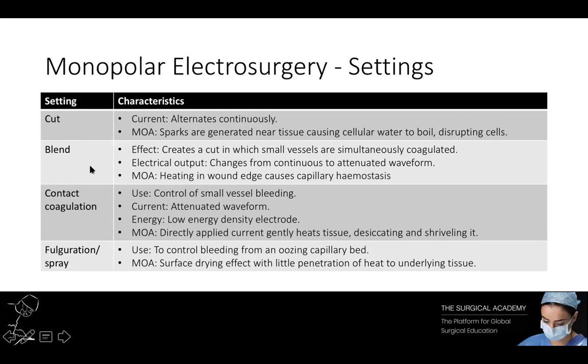The blended cut technique creates a cut in which small vessels are simultaneously coagulated. Selecting the blended cut switch changes the electrical output from a continuous waveform to an attenuated one with a short off time between bursts of electrical activity. The first incision will usually be pure cut with the second incision usually being blended cut. This waveform allows some heating at the wound edge, resulting in capillary haemostasis.